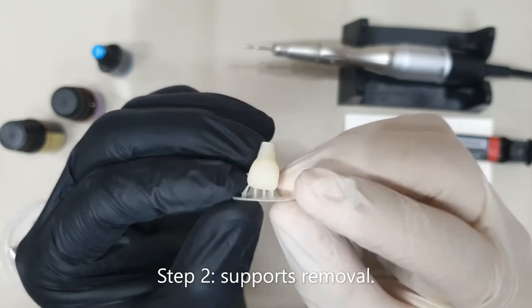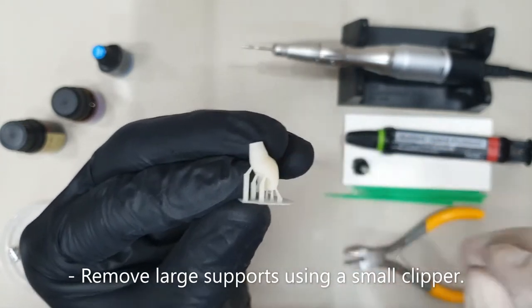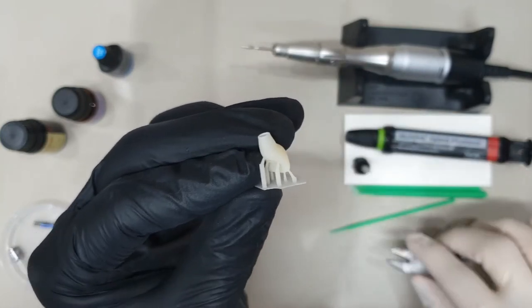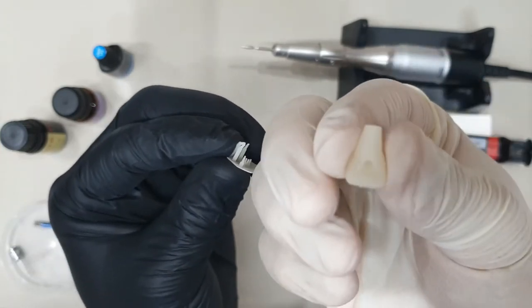In case you have small supports like in this case, you could just snap them off by hand. But in case you have a much larger support, you could use a clipper to clip them out. In this case I'll use my hands to clip off the supports — and this is how they twist off.